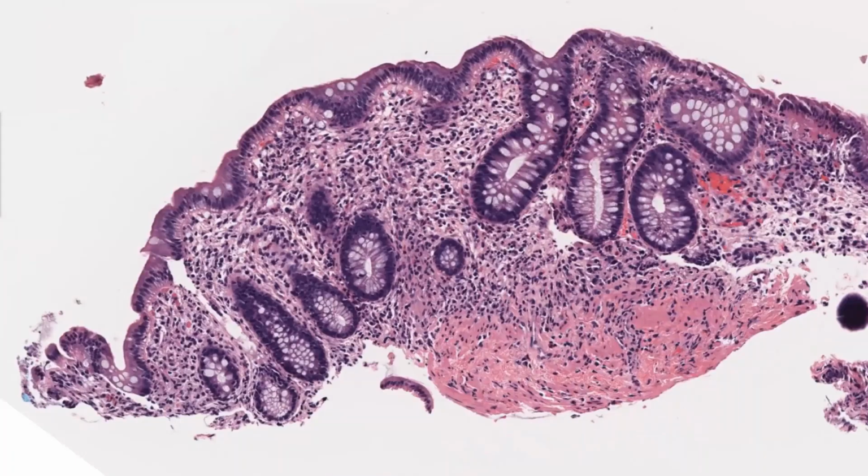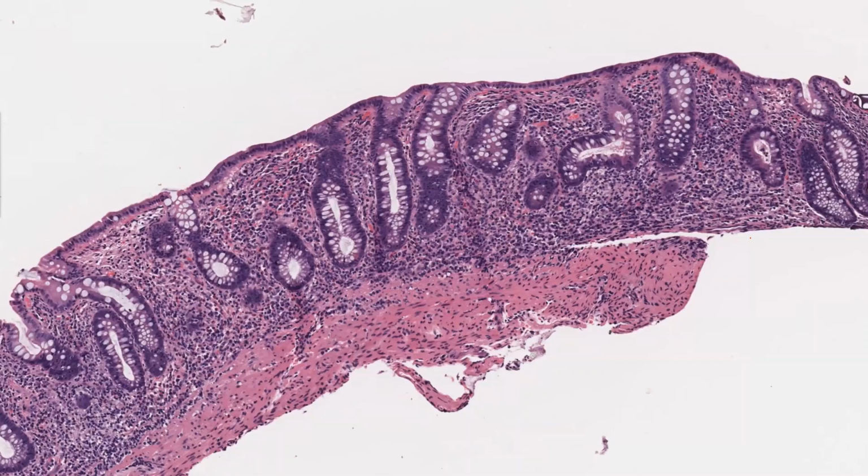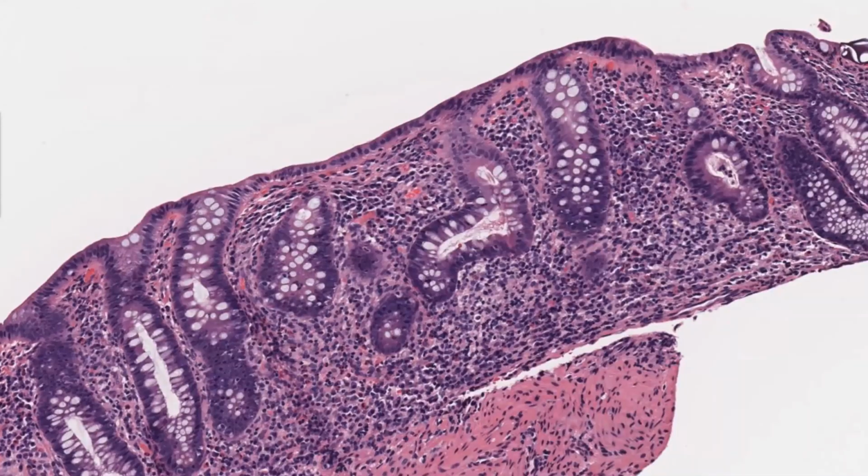Here again, there are not a lot of crypt architectural distortions, just subtle angulated crypts. But here is another biopsy from the same patient, from the same area, showing this horizontal alignment of the crypts. So there is definitely some mild architectural distortion present. You can see now that the gradient is lost in this biopsy, so you have an increase in chronic inflammation. And that's the close-up on this biopsy to confirm what I have just said.